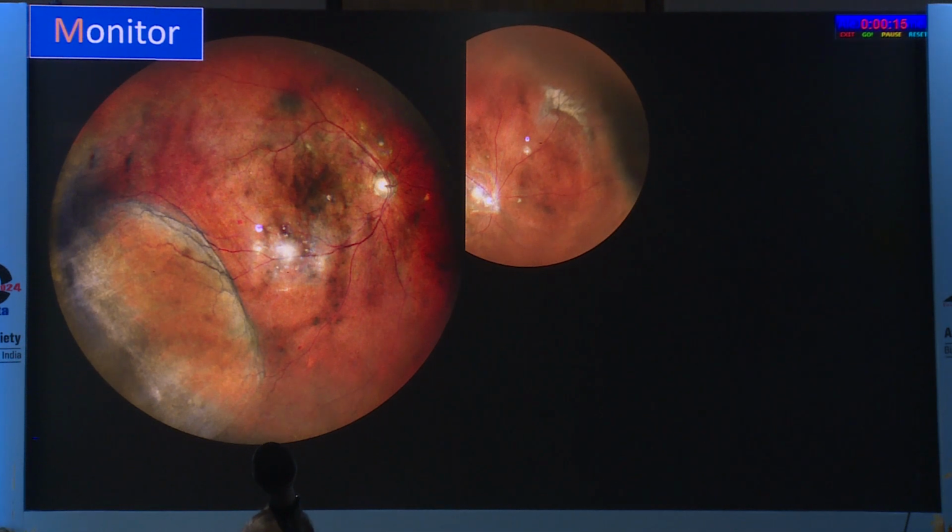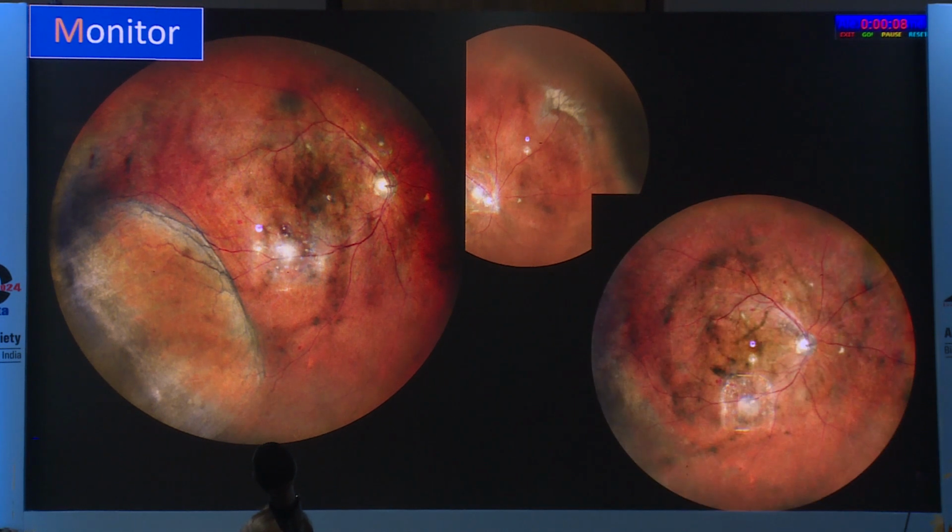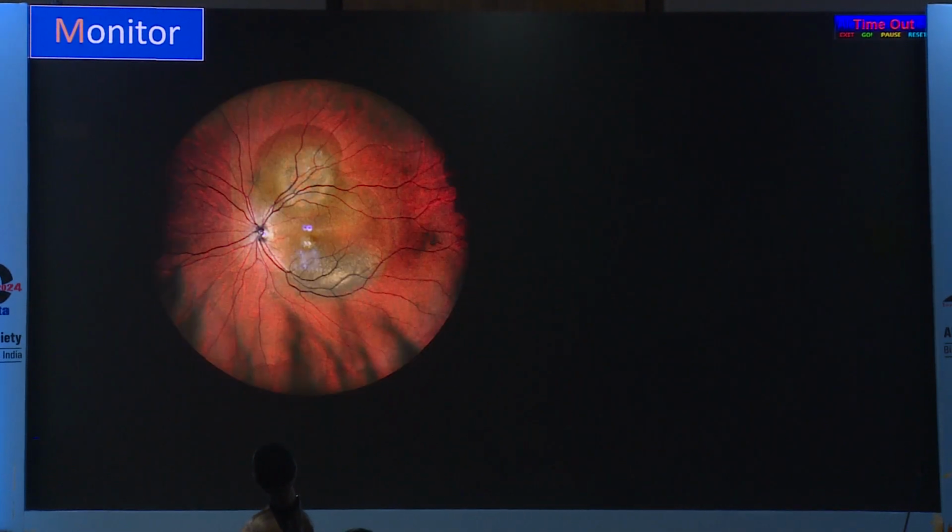Had a puffy face and puffy legs along with similar effusion in the eye. All we had to do is closely observe this patient. As the symptoms of acute renal failure subsided, so did the choroidal detachment and the subretinal fluid. So it is extremely useful in monitoring cases and to analyze cases when you are at the crossroads and don't know what decision to make.